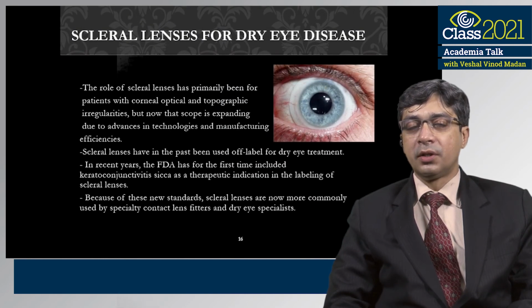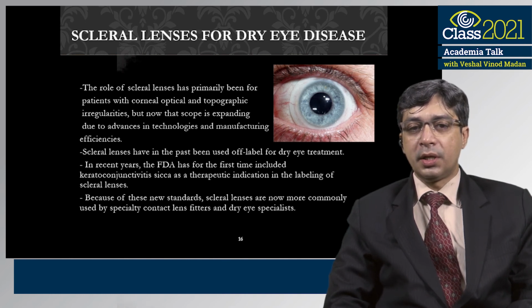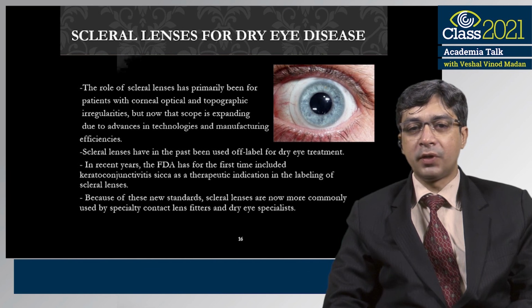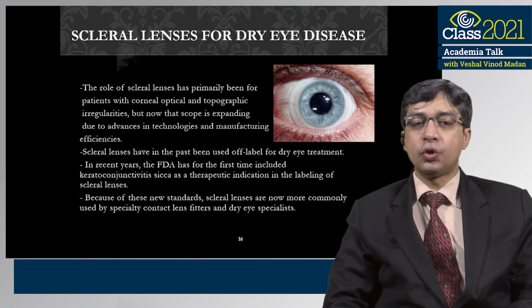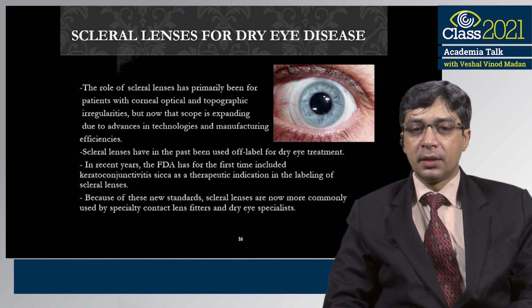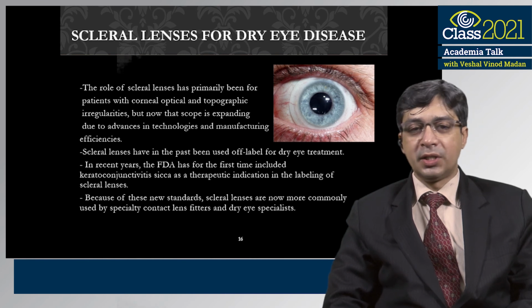Scleral lenses are very much in trend, and they are shown to have very promising results as far as moderate to severe dry eye conditions are concerned. Scleral lenses are highly safe and have ample benefits, with good optical as well as physiological properties, and they have been shown to alleviate dry eye where other therapies and management procedures fail. Scleral lenses come with different modalities and suit all age groups, whether children, teenagers or adults. They are very acceptable and easily usable.